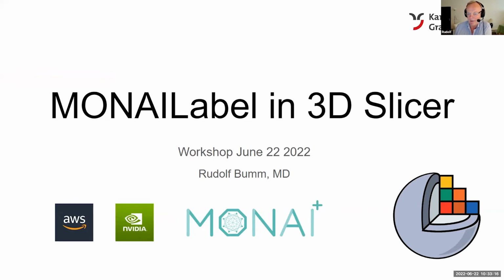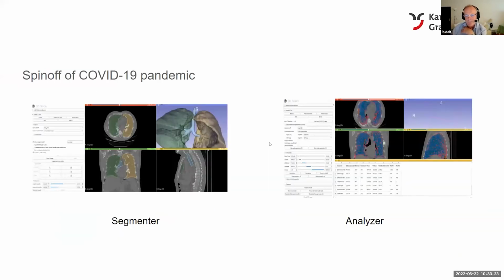I'm a senior consultant surgeon at Kantonsspital Graubünden in Chur, Switzerland, and I got involved in this by programming the lung CT analyzer, a program which can make lung segmentations and analyze the lung areas according to thresholds. This was kind of a spin-off of the COVID-19 pandemic.